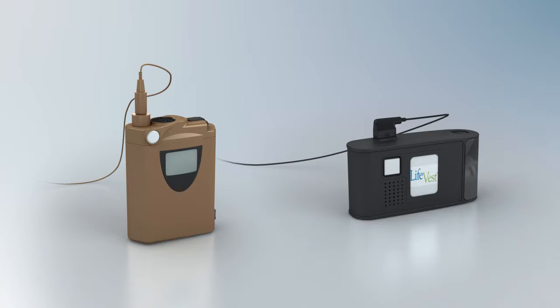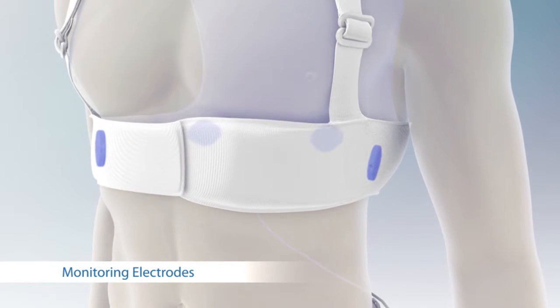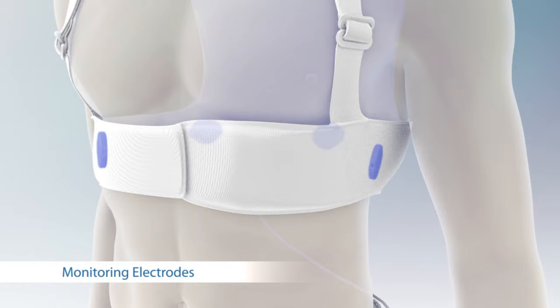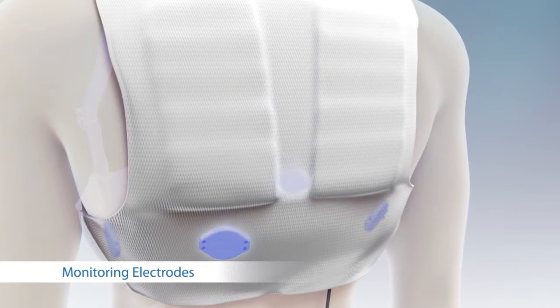The LifeVest has two models shown here. Though differing in appearance, both models are equally effective at detecting ventricular arrhythmias and delivering life-saving therapy. The LifeVest system uses four ECG electrodes around the patient's body. One pair of electrodes provides a side-to-side channel of the ECG signal, and the other pair provides a front-to-back channel.